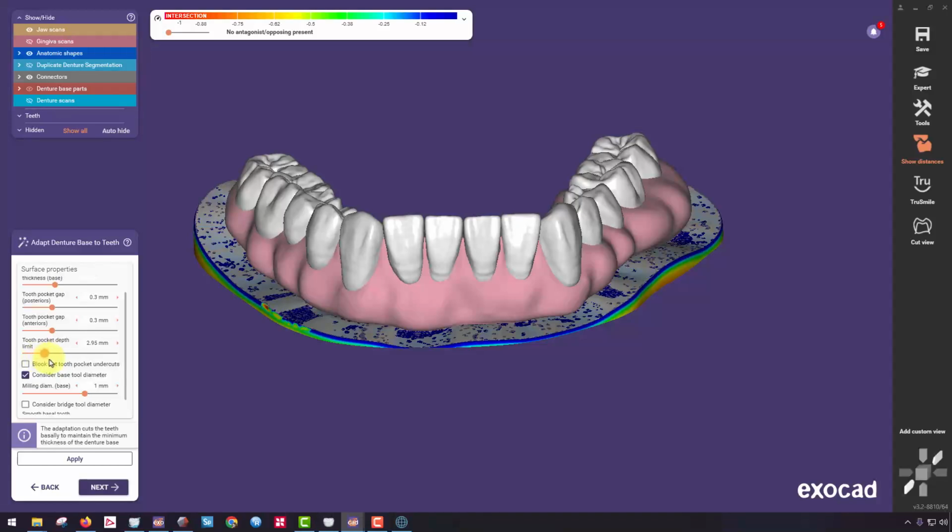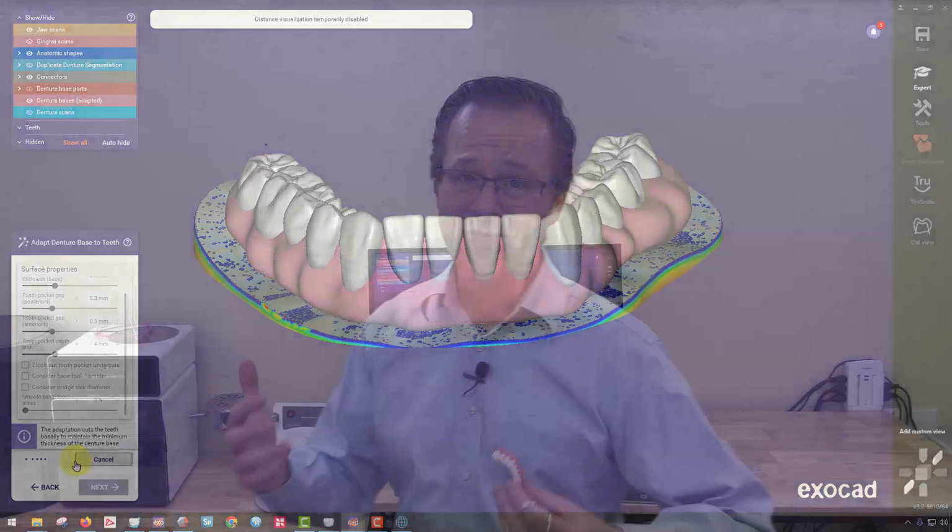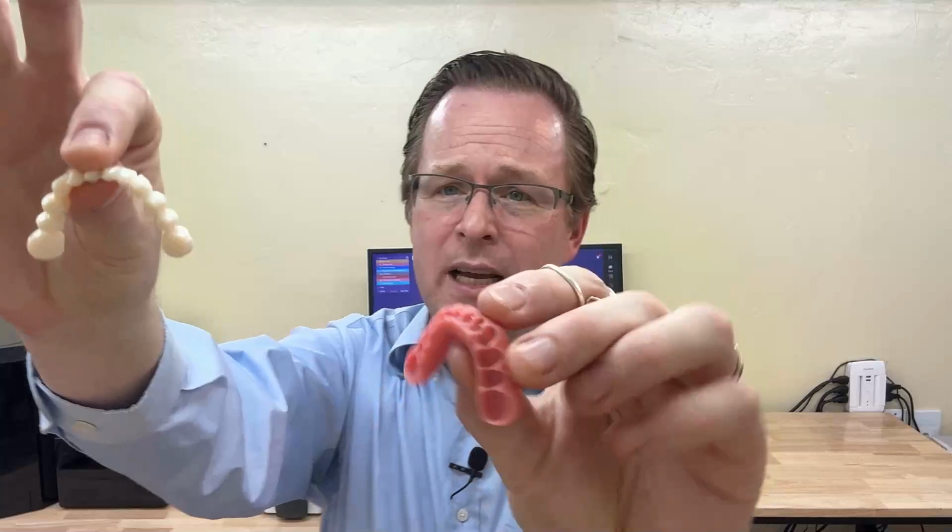So the reality is that I'm going to leave most of this as default. That should be 4. Okay, now since I'm 3D printing, I'm going to leave all of that as default, and now just go ahead and click the apply button. Let the computer calculate, because now this creates that ideal space where that just slides right into place.